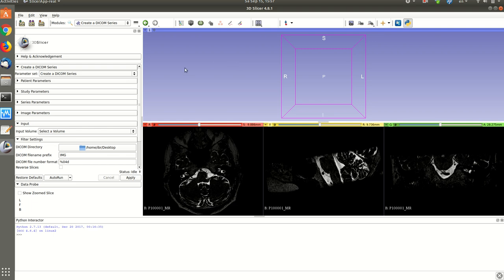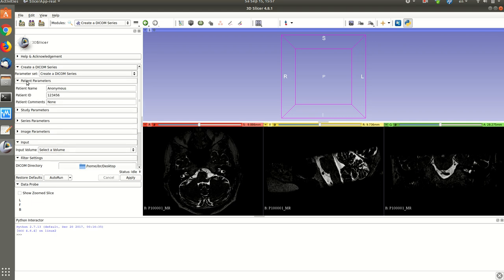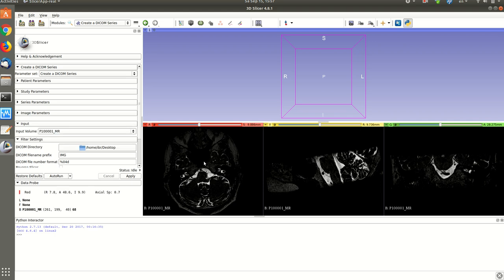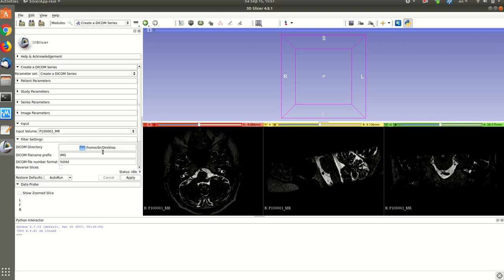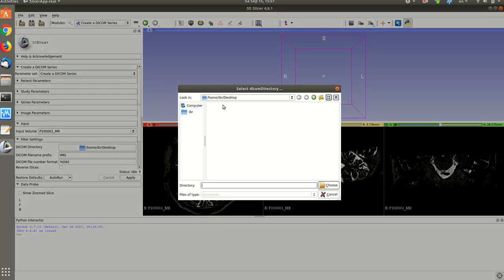So what you need to do is you can change all these parameters, patient parameter or different study parameters, then select the volume. For example, I select this MRI image.